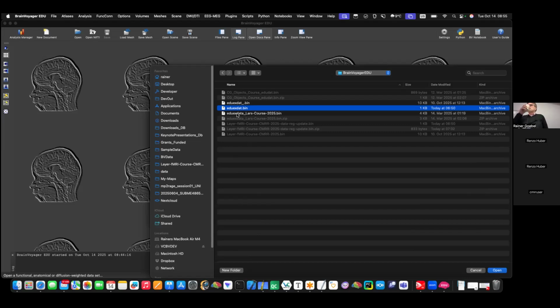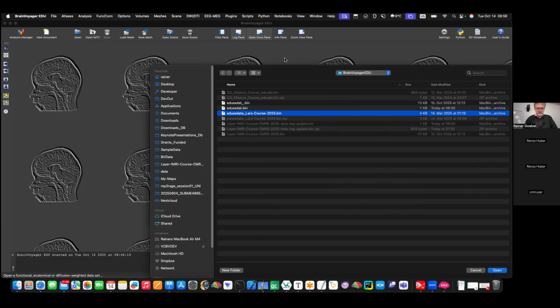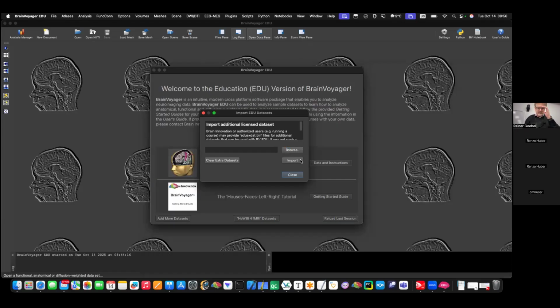Those of you on Windows, this is not for you; it's only for Mac. Mac is more picky, because it's basically an extension of the license. It looks for a file with a specific name. Windows saves it automatically in the right place; on Mac it lists the library application support folder. You browse to it, just say import, that's all. If you have this file, good. Rename it, press import once you have browsed it, and then it should be fine.